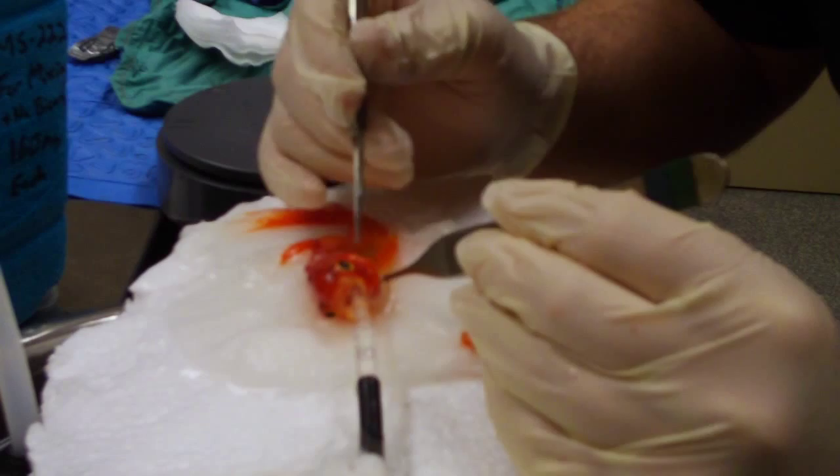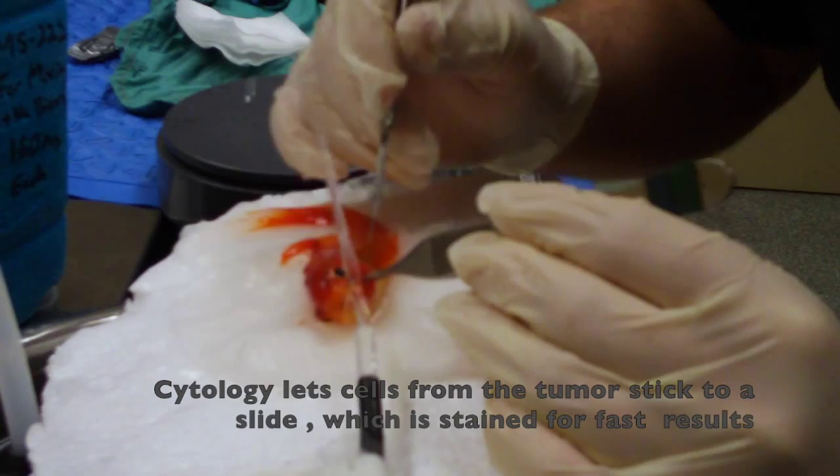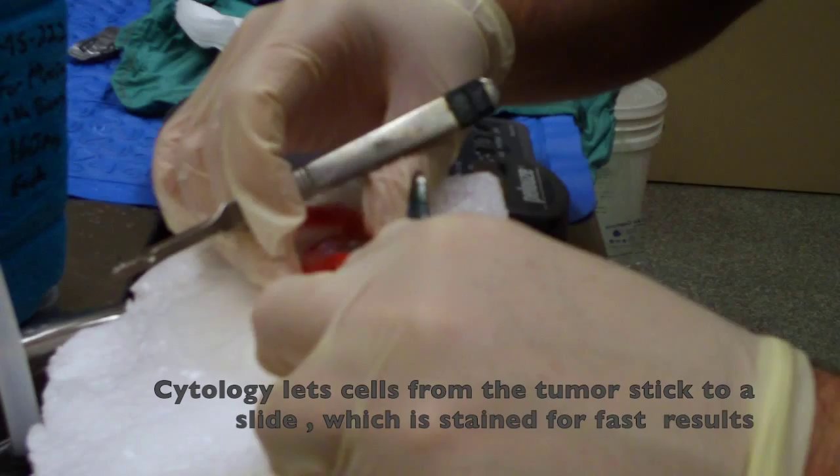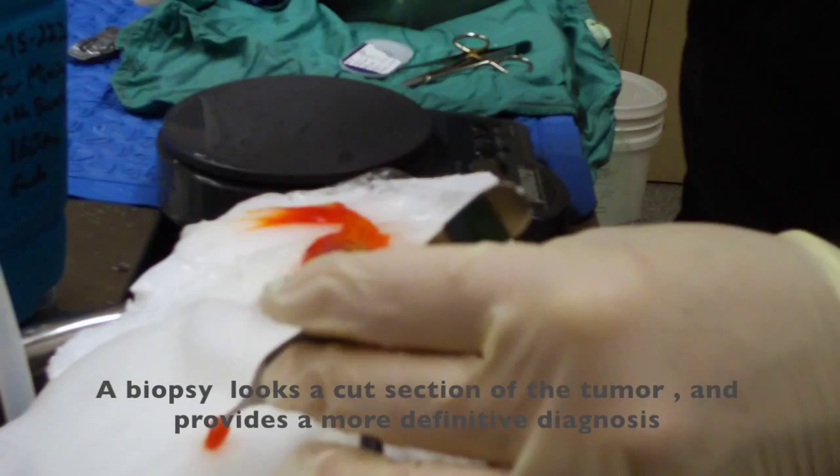The mass is off now. There's a bit of a divot here. We're going to try to scrape the bed in case there are tumor cells or any infection — there are some infectious agents that may still be in there. We're going to get a cytology of it before we fix it formally.